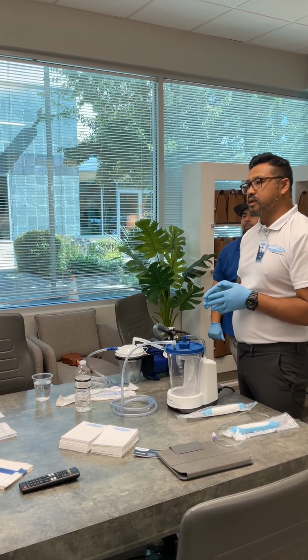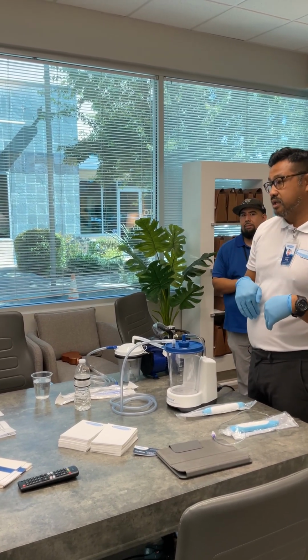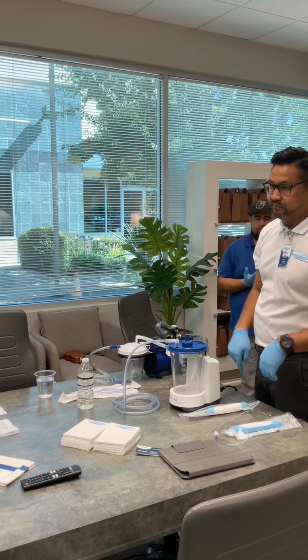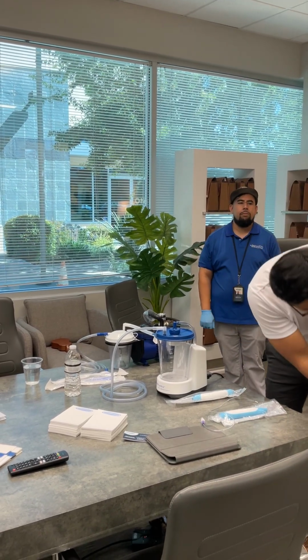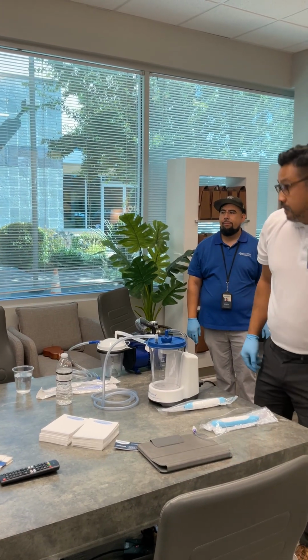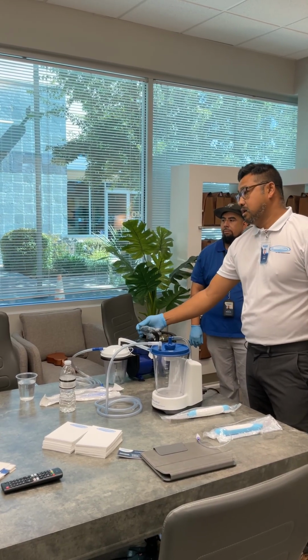So when you do order it, sometimes it says GOMCO on the portal. If you put GOMCO, we're thinking gastric decompression suctioning, the one that goes into the nose down into the stomach, or the G-tube. So just identify if it's oral or gastric. They're not interchangeable. You shouldn't be using this for gastric. This is very strong suctioning, and you can't turn it down.